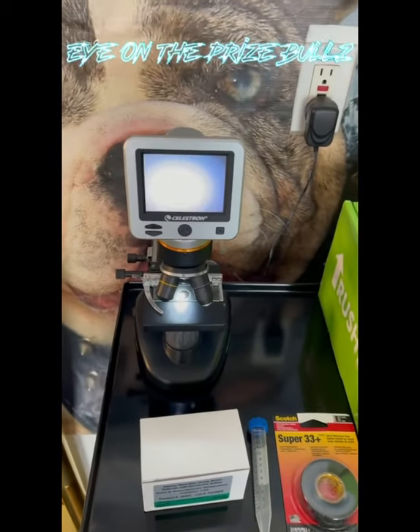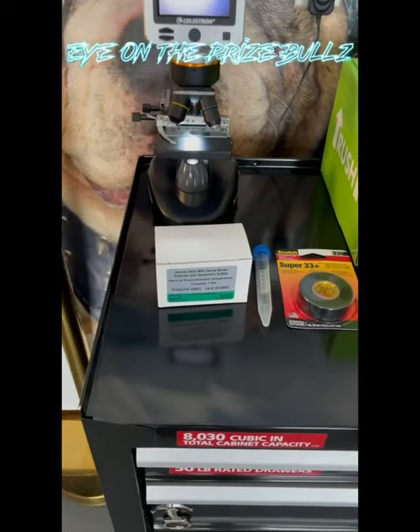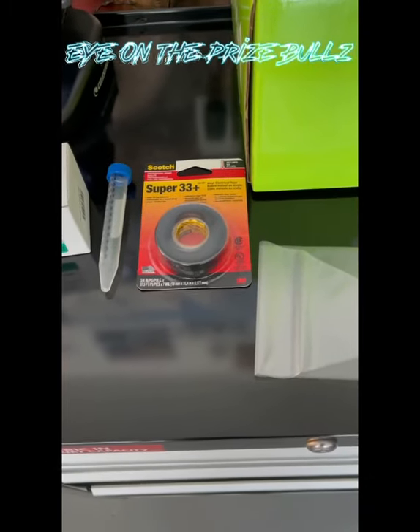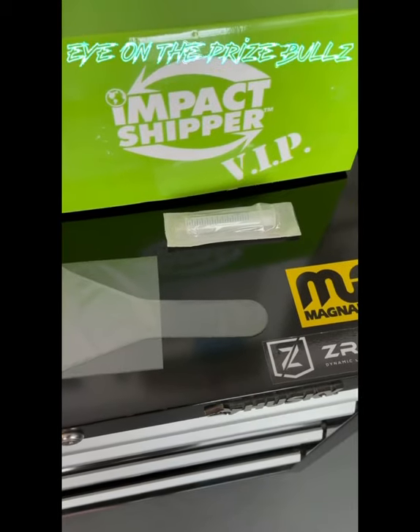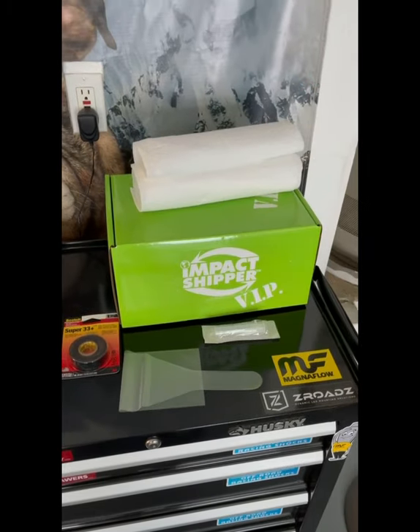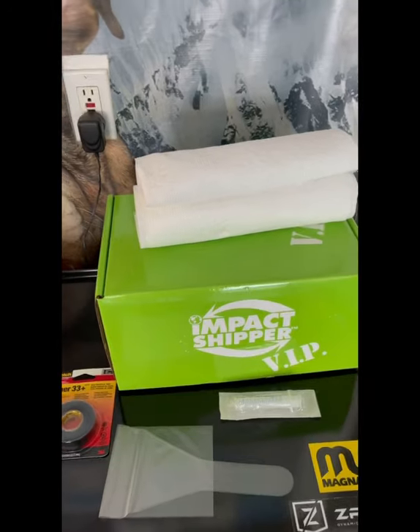We have our microscope, we have our extender with Dr. Kenny's gentamicin in it. We have our collection tube, black electrical tape to seal it, collection bag and a syringe. Here we have our Impact Shipper VIP box that comes with ice packs ready to go. Alright, let's get started.